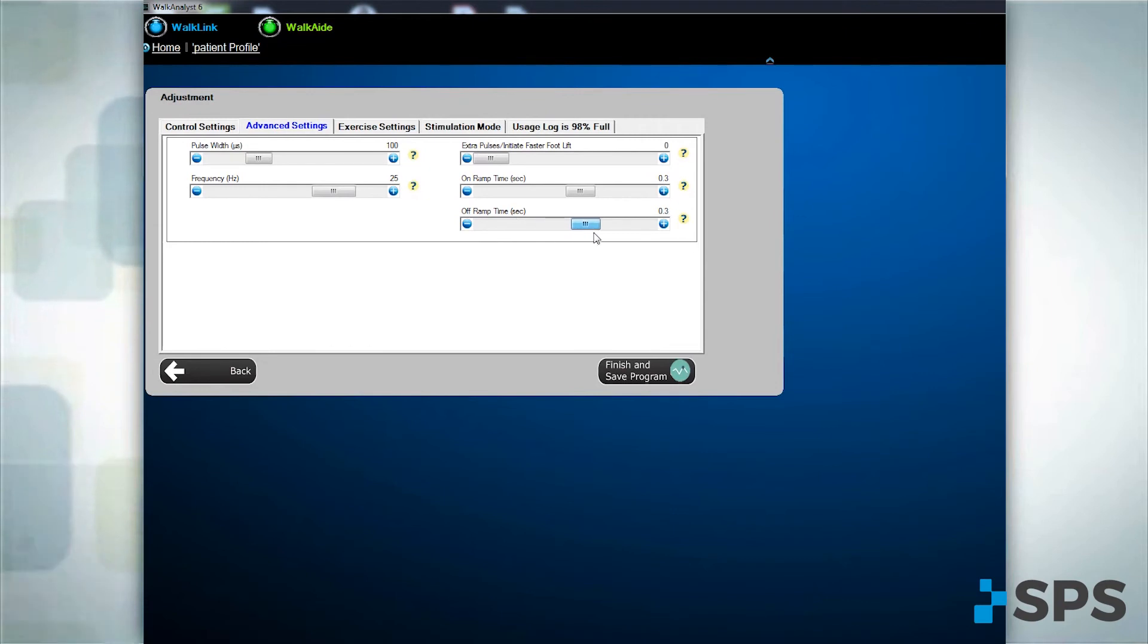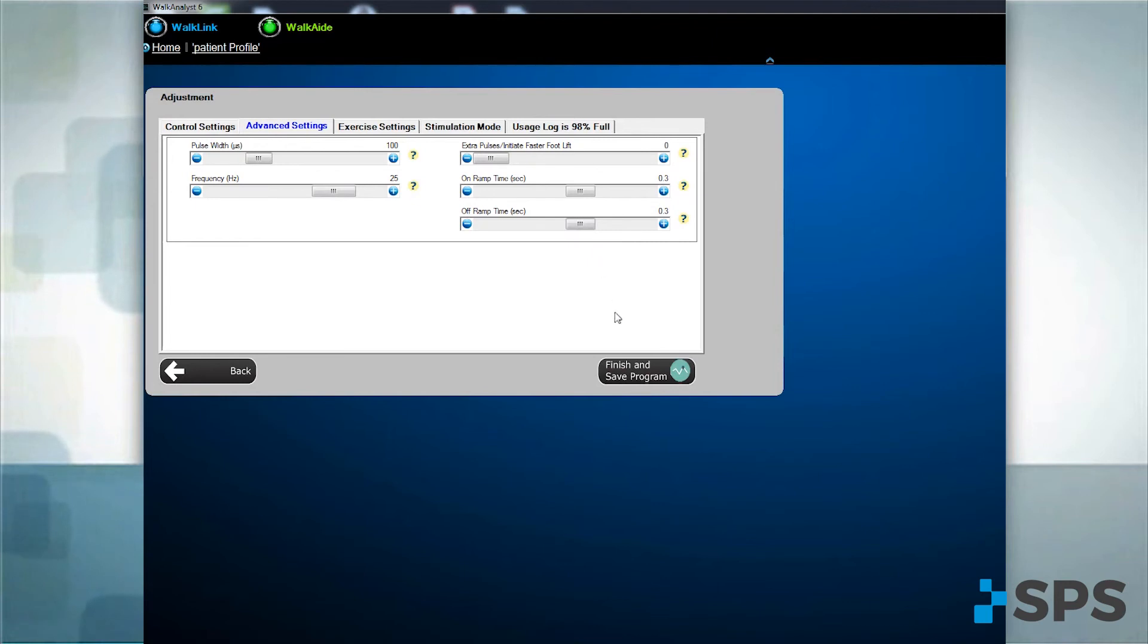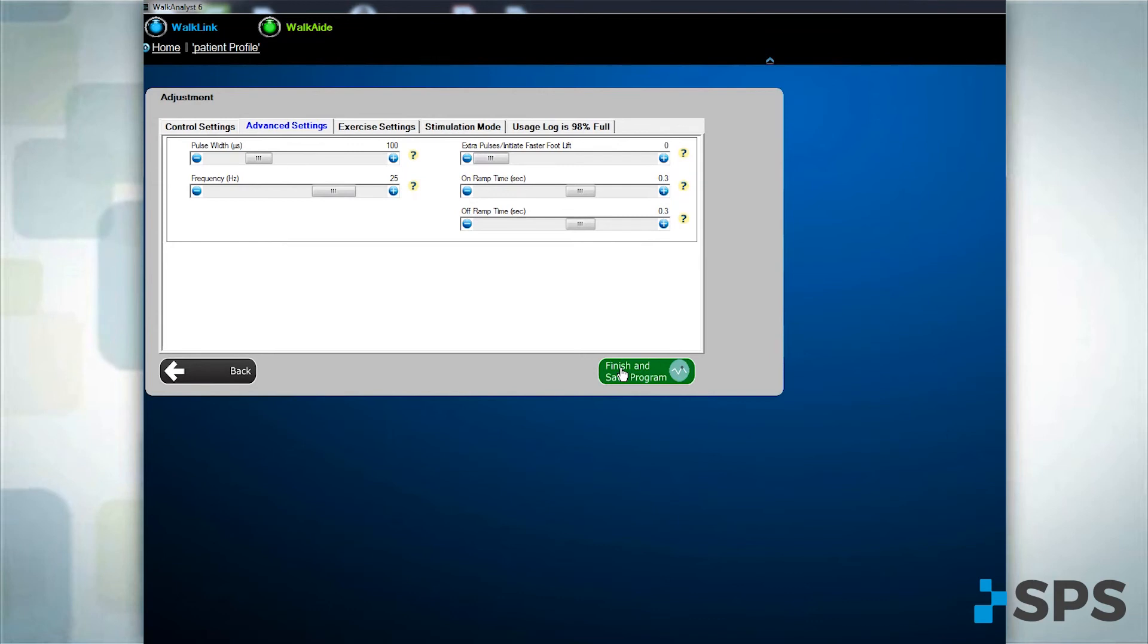Add an off-ramp to mimic eccentric control of dorsiflexion. For example, control foot slap or allow tibial progression over the foot to inhibit knee hyperextension.